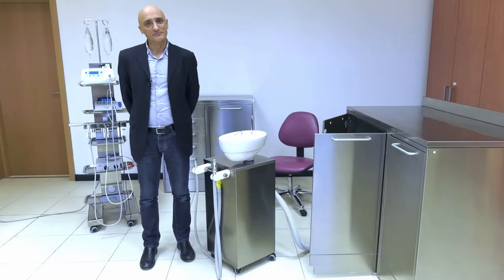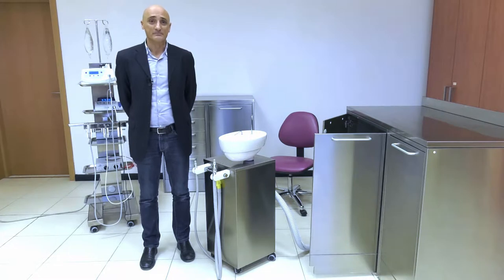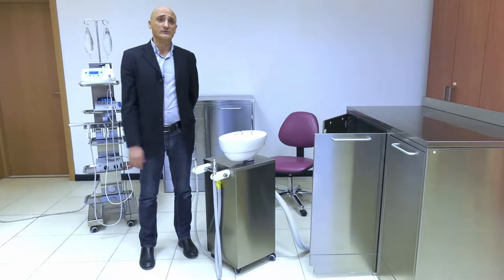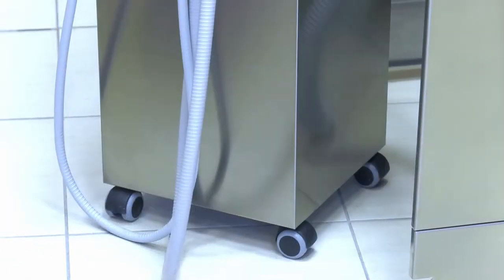Hi, my name is Michele Cirillo. I am product specialist at Tecnomed Italia for the handy surgery line. Welcome to the Aspirol section.